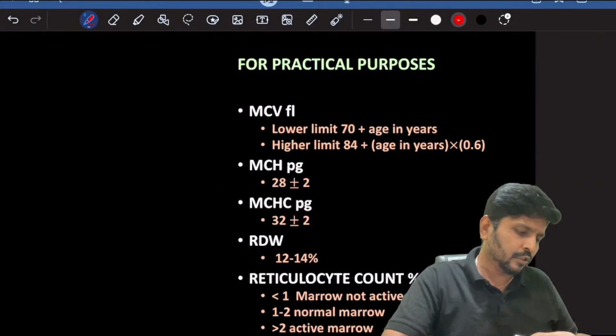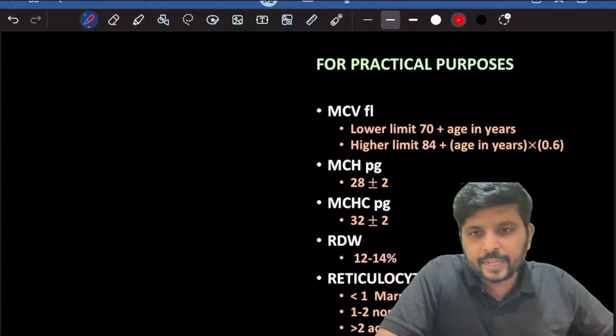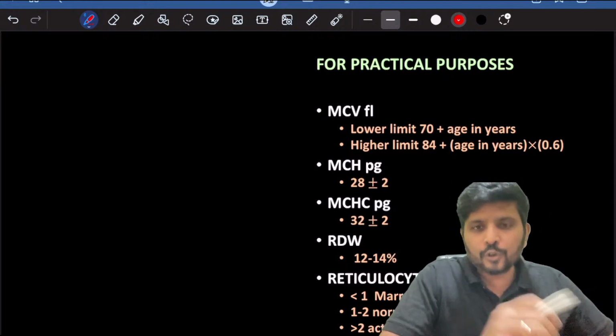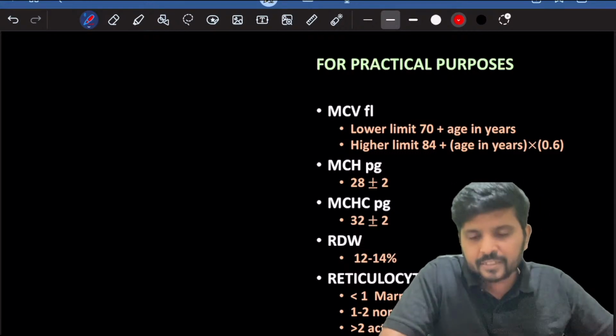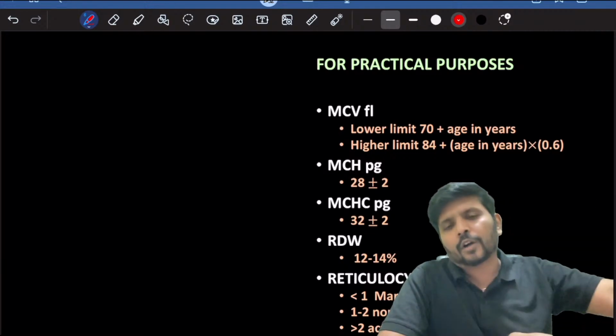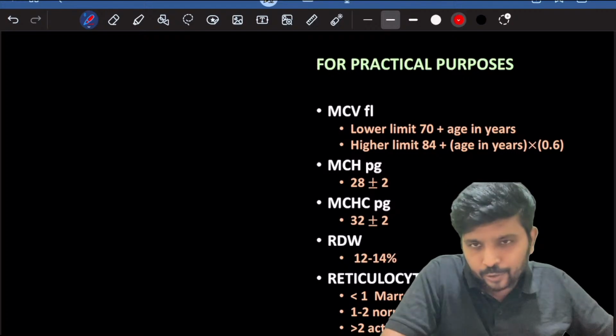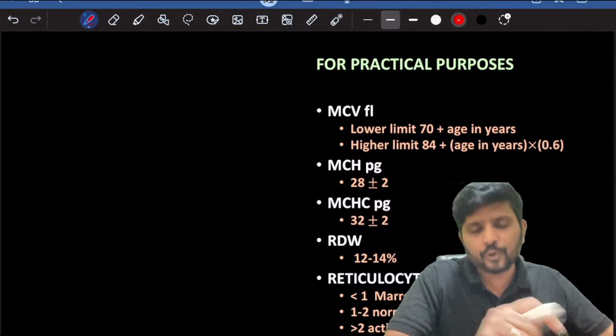Right, what else? With this, the basic introduction to the automated hemogram is over. So tomorrow, kindly revise this and come. We are going to apply true automated hemograms, and you are going to find out the diagnosis based on today's discussion.